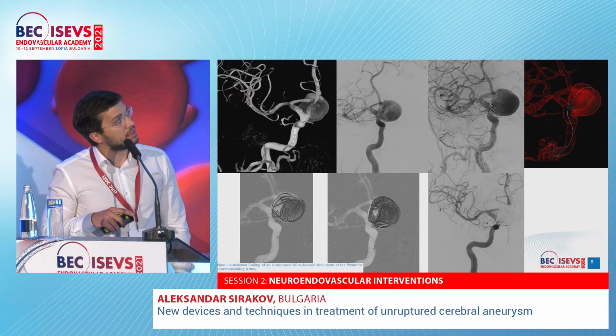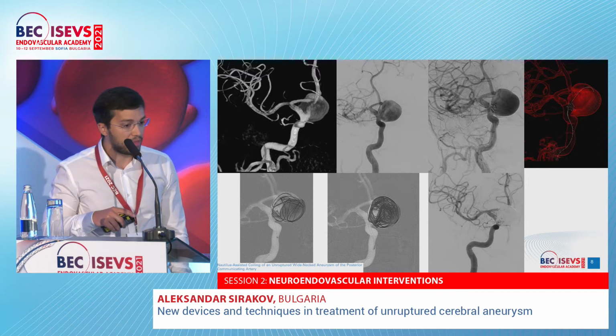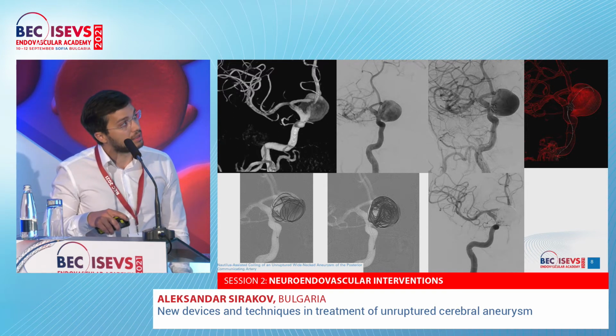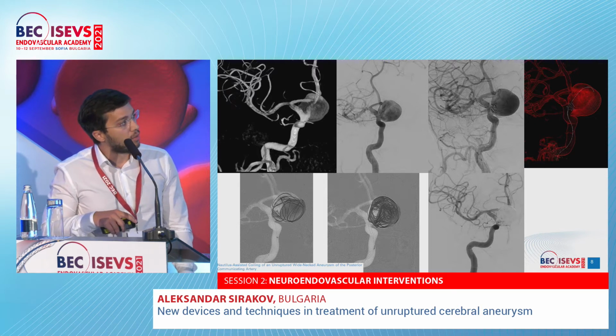Once it gets fully introduced into the aneurysm sac next to the equatorial plane of the aneurysm, it forms a discus shape, which can be deployed at the level of the neck and help you to completely remodel the aneurysm. It has a central pore, that you can use a second microcatheter to navigate through and start deploying coils. So you achieve good occlusion rates.